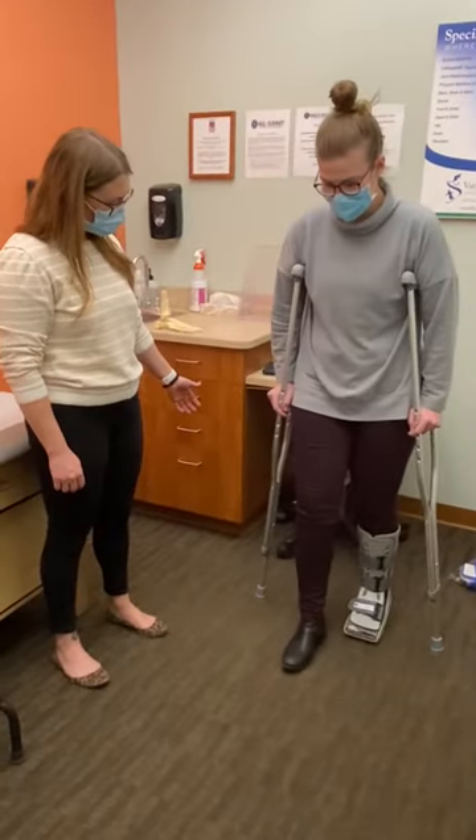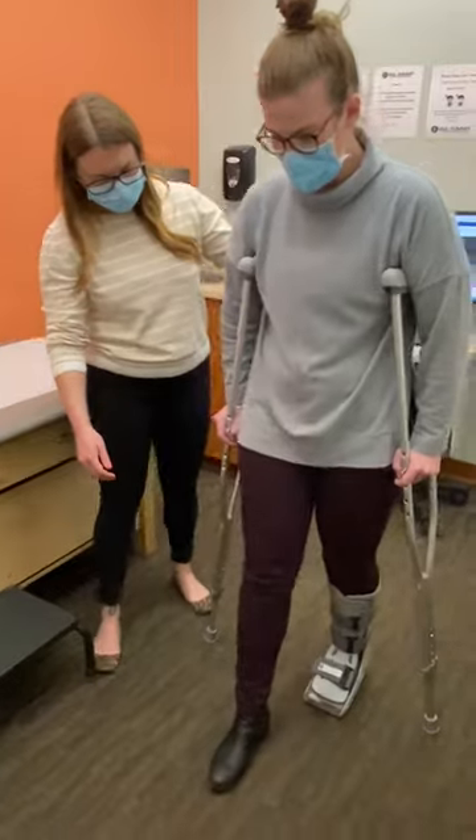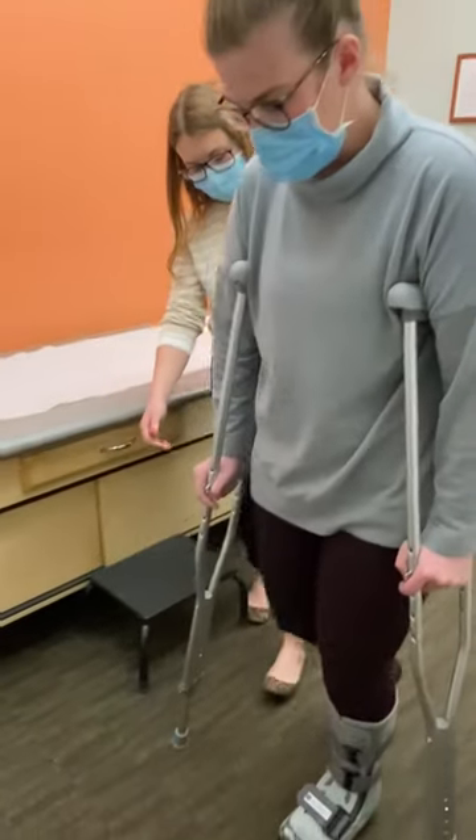When using your crutches, you will lead with your good leg and then follow through with your injured leg and crutches, applying gentle pressure.